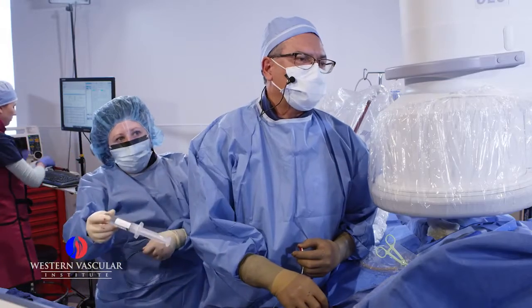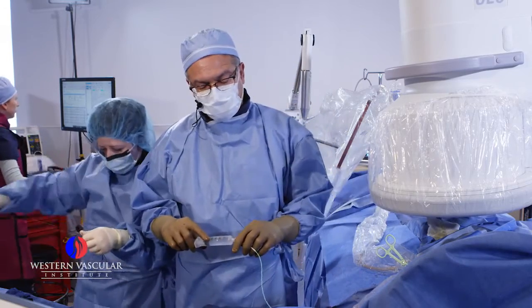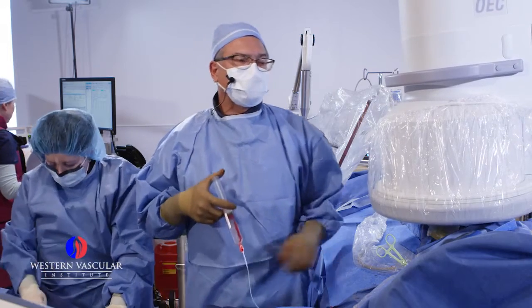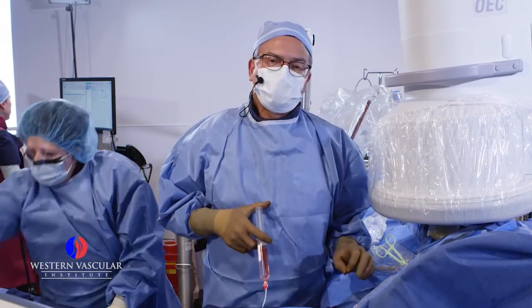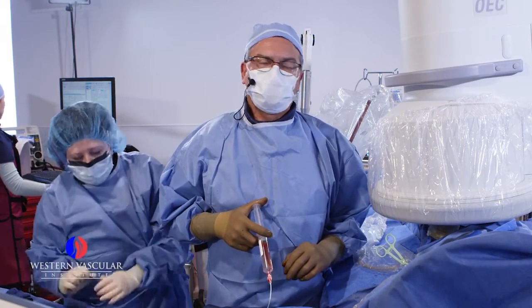So right at this level, we have the end of the catheter. We're going to hook this with a syringe containing some dye, or contrast material. We're going to inject that, and that will give us a mapping or the configuration of the aorta. In that way, we can identify where the blockages are.